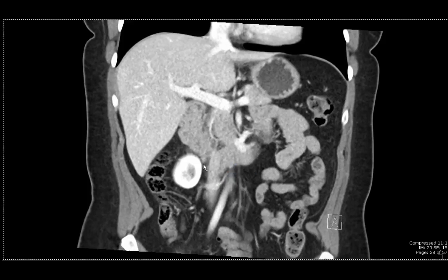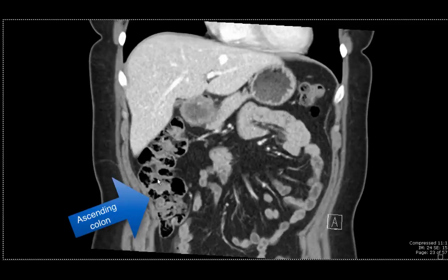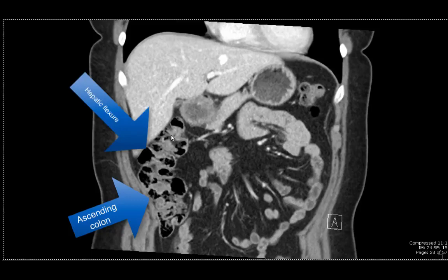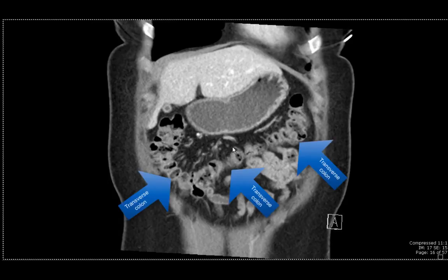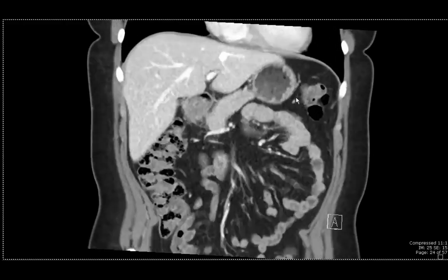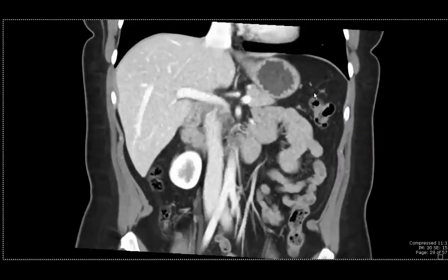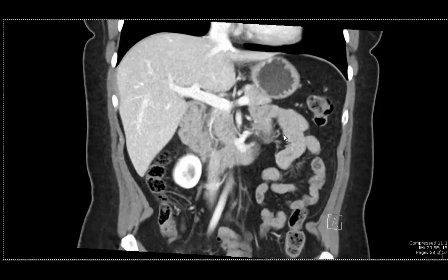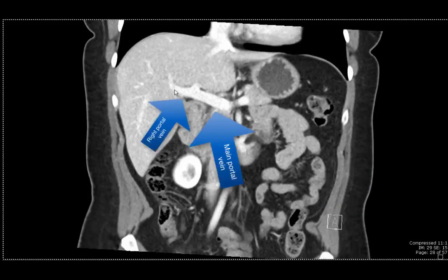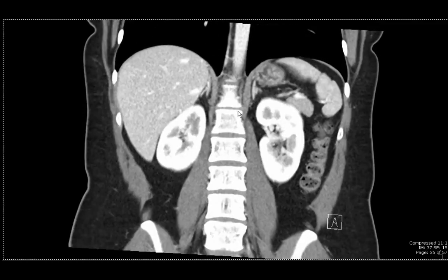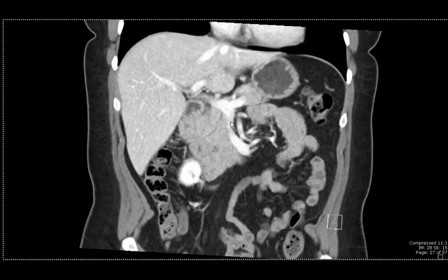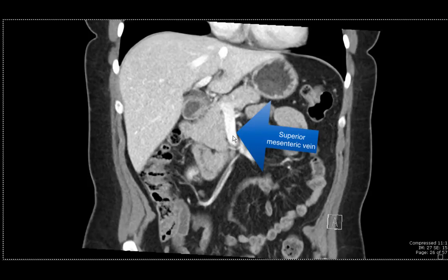We can also see portions of the large bowel: the ascending colon, and around this area the hepatic flexure where it becomes the transverse colon. The transverse colon goes all the way across the midline and up again in the left upper quadrant to the splenic flexure, then downwards as the descending colon. On this image we can see the main portal vein splitting into the right and left portal veins. The splenic vein drains from the spleen into the main portal vein, and the superior mesenteric vein drains the small bowel and majority of the colon into the main portal vein.